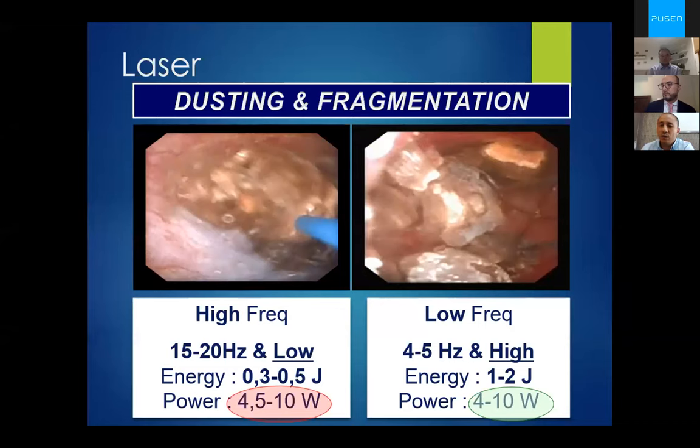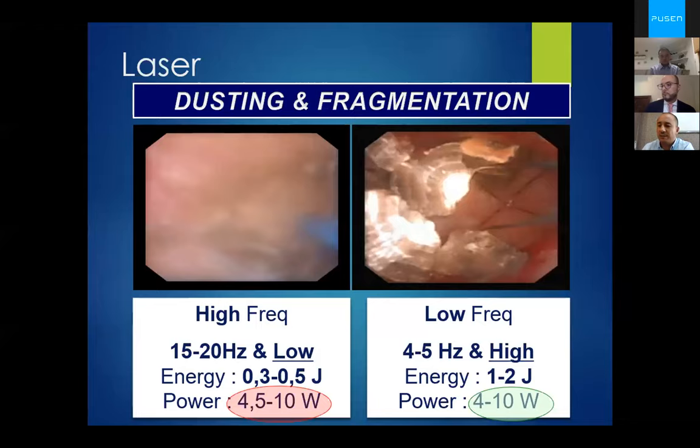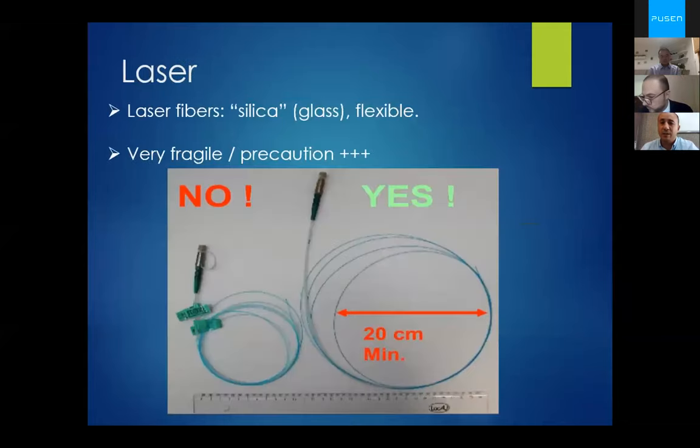Generally, there are two modes: dusting with high frequency and low energy, or fragmentation with low frequency and high energy. There is a third mode, the popcorn effect. I will try to be faster.